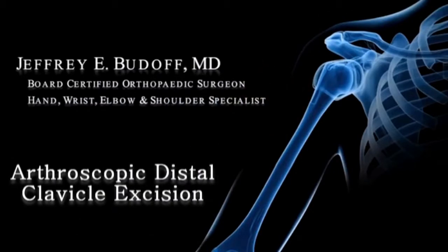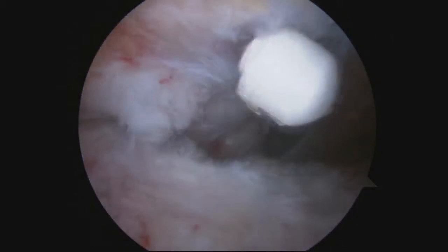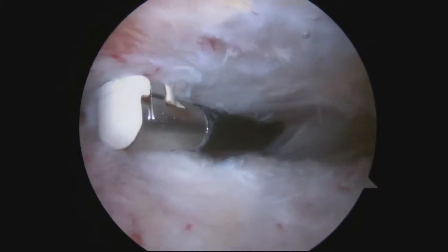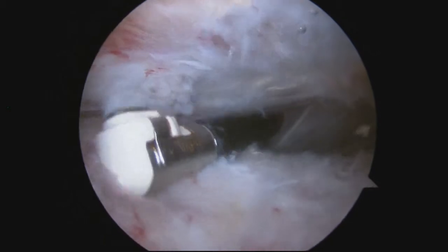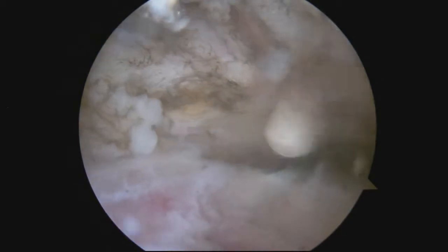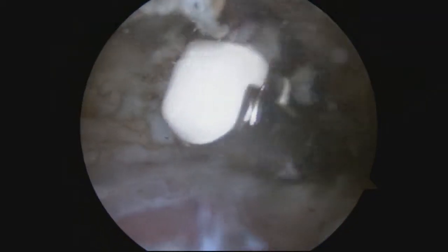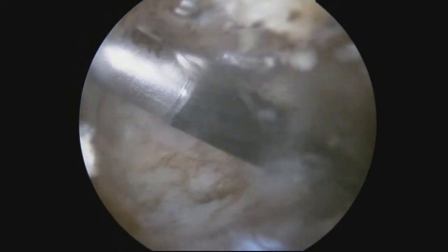Arthroscopic Distal Clavicle Excision for Acromioclavicular or AC Joint Arthritis. Working in the subacromial space just below the AC joint, now using the radio frequency device to clean out the soft tissue and expose the AC joint — that gap between the two bones that you see there.